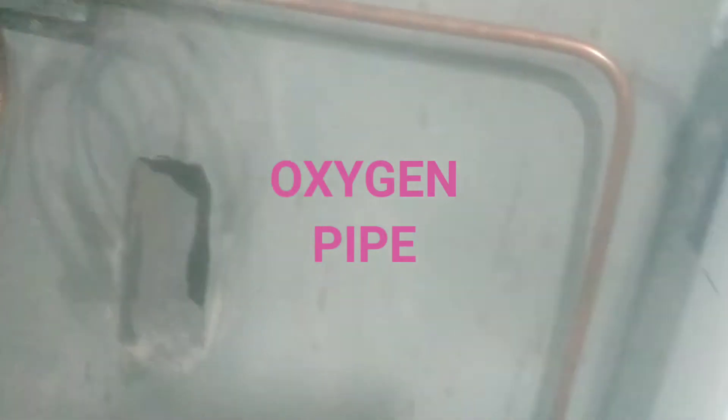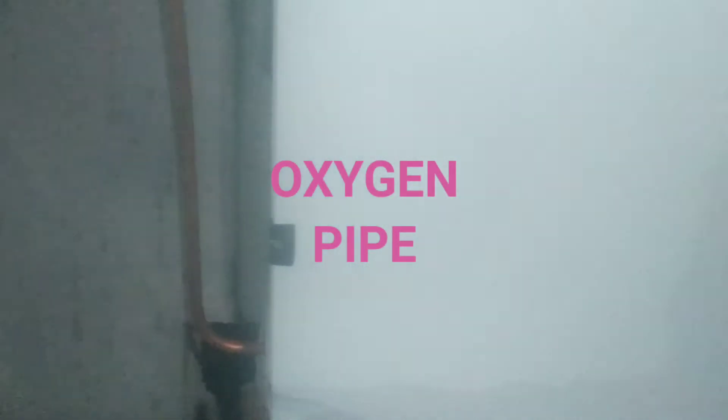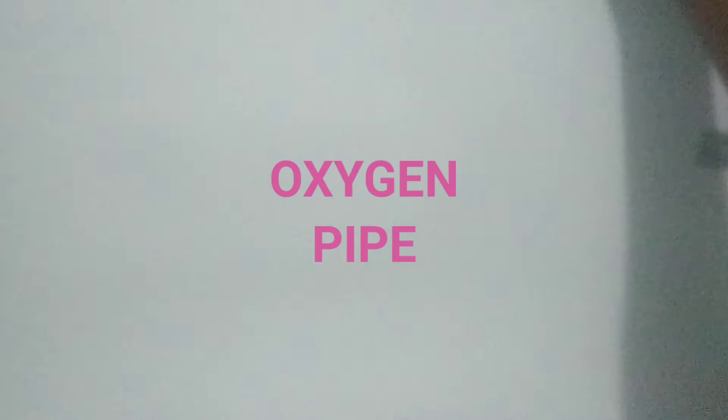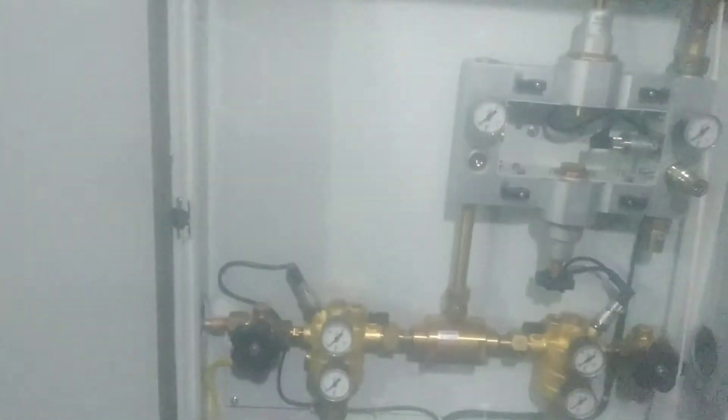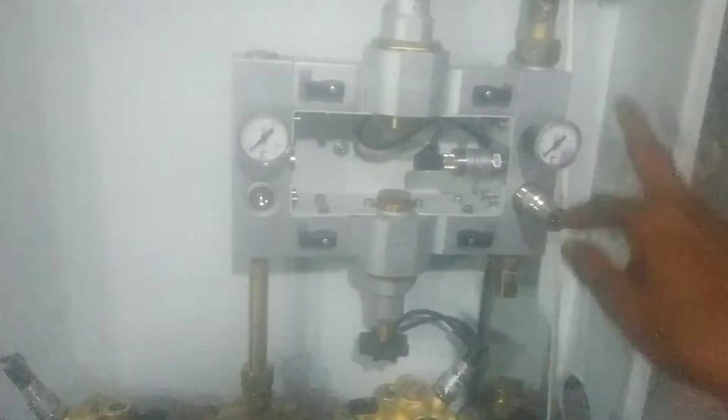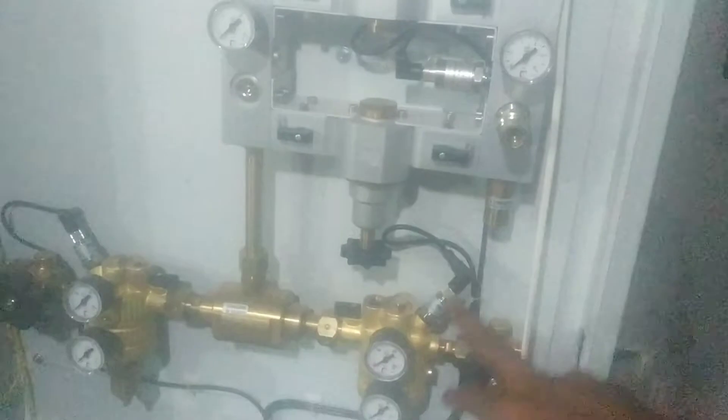The oxygen goes through here and enters into this manifold. It enters into this manifold, which then passes through gauges and all this mechanism — valves, there are valve gauges.